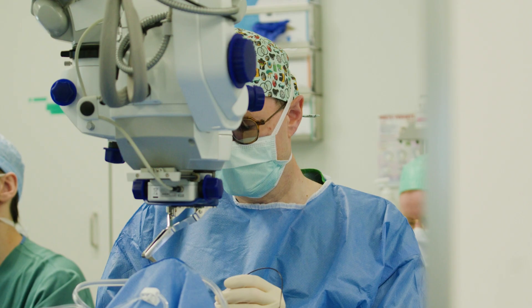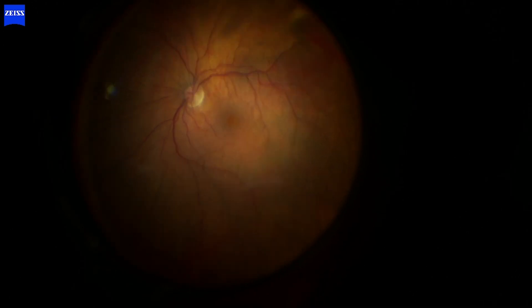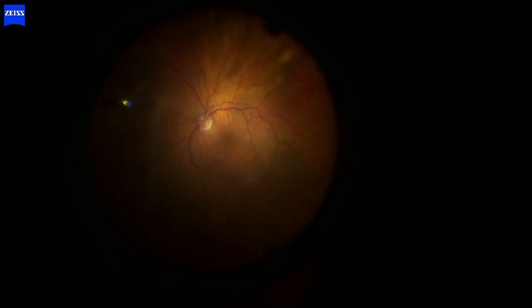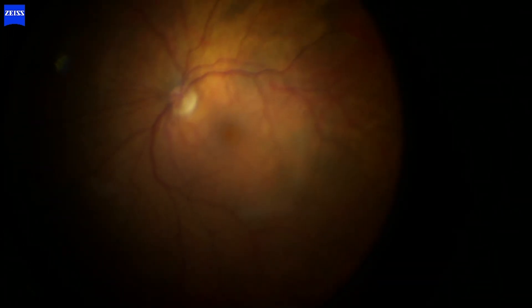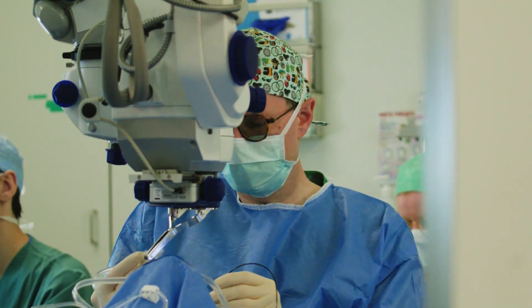I will show you the difference. Let me start by using the classic reusable ReSight lens. This is the image quality you get with the traditional 128 diopter lens. Now I will switch to the new wide-angle disposable lens. I think it's very obvious how much better the quality is. If you're not convinced, I'll switch back to the old lens — zooming and focusing again. Old lens, back to the new lens. You immediately see there's a huge image improvement.